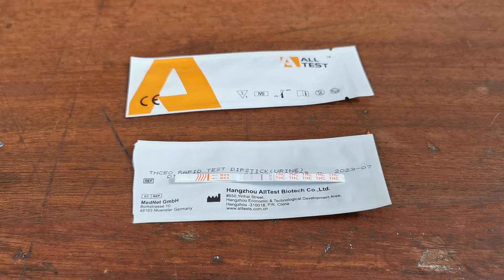For a positive test, to interpret that correctly you must wait for the complete development time as specified in the instructions. But if you're getting two test lines at an early stage, that is a clear negative result.